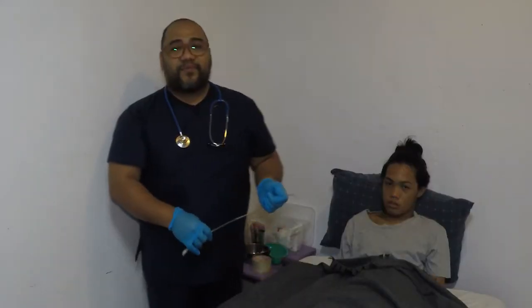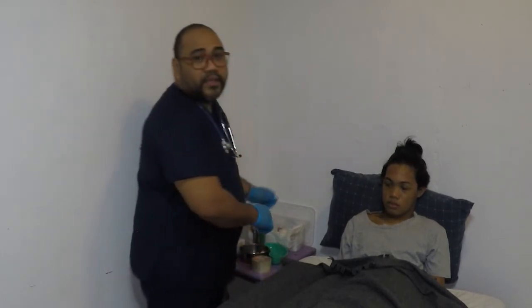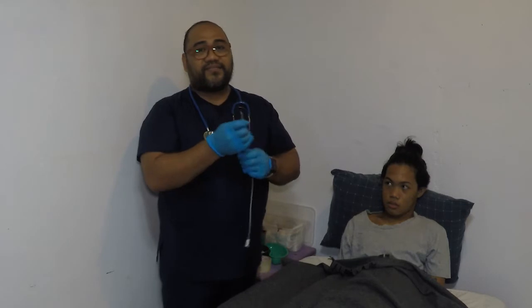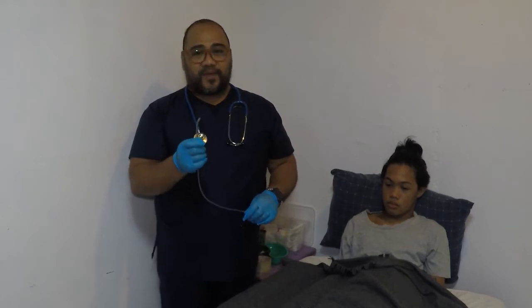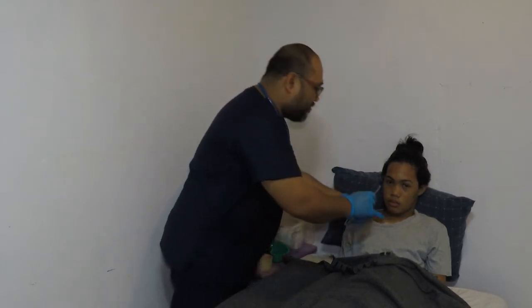Then lubricate the tip of the tube at least 1.5 inches with a water-soluble lubricant. This will reduce the friction and facilitate passage of the tube into the stomach. Xylocaine jelly may not be recommended to use as lubricant due to the risk of xylocaine shock. Water-soluble lubricant will not cause pneumonia if the tube accidentally enters the lungs. So insert the tube into the nostril by directing the tube downward and backward.